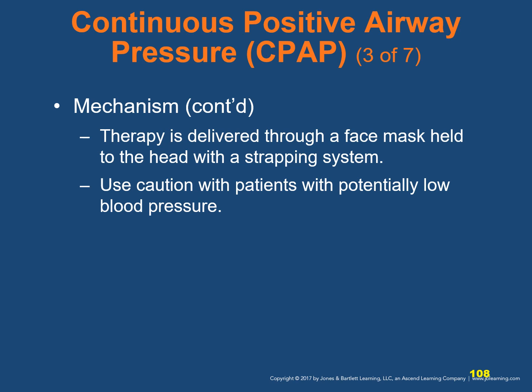Many CPAP systems use oxygen as the driving force to deliver the positive ventilatory pressure to the patient. Use caution with patients with potentially low blood pressure because CPAP causes a drop in cardiac output.